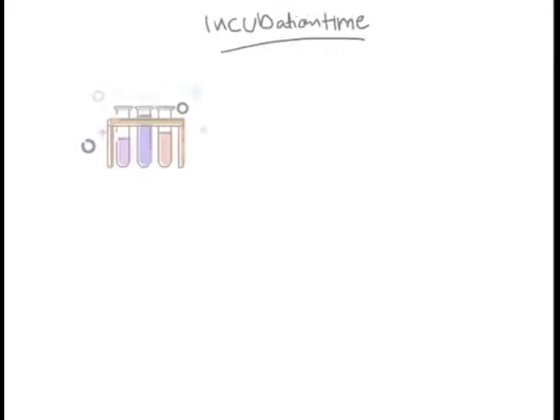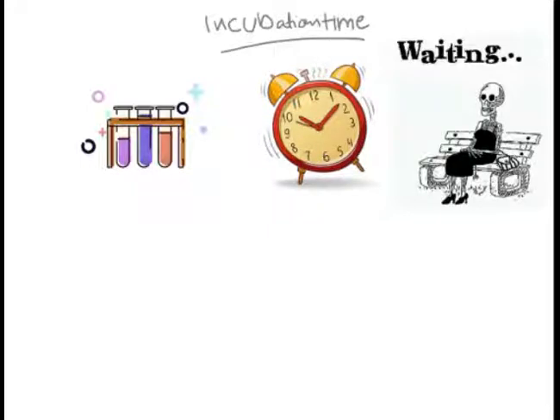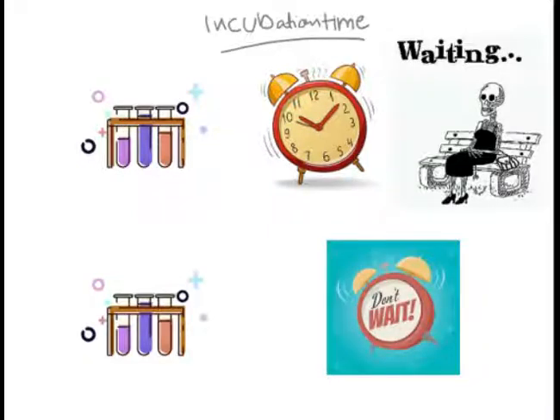Some tests and reagents require a specific incubation time to allow for antibody to bind to the antigen. However, other procedures may require immediate spin, so there is no incubation time required. pH also plays an important role in the sensitization step.